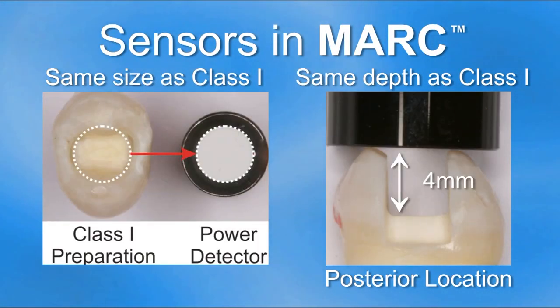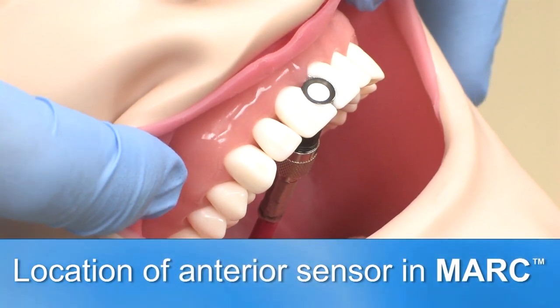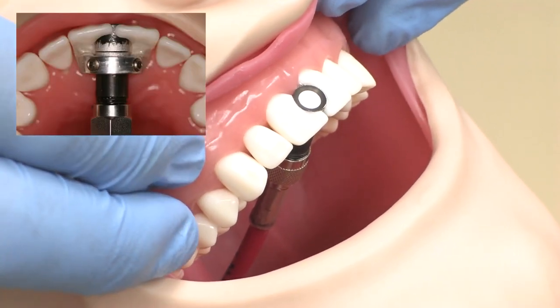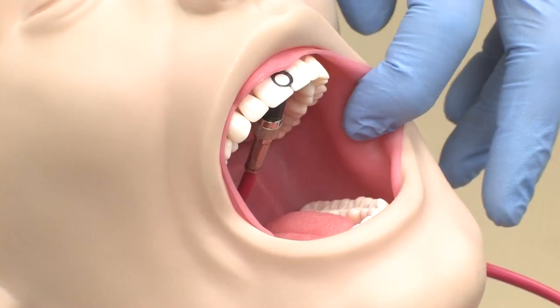In the posterior region, the sensor is 4 millimeters from the cusp tips, and the sensor is approximately the same size as the Class 1 preparation and is 3.9 millimeters in diameter. Here we can see the anterior sensor, which is 1 millimeter from the facial surface between the two central incisors, representing a facial Class 3 restoration.